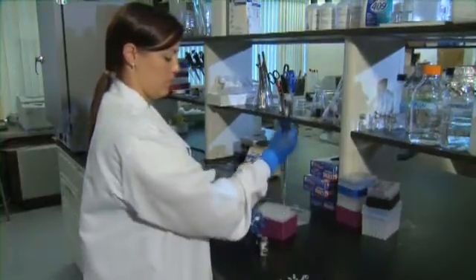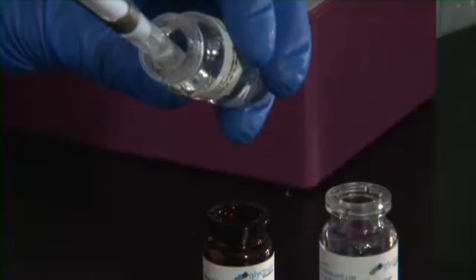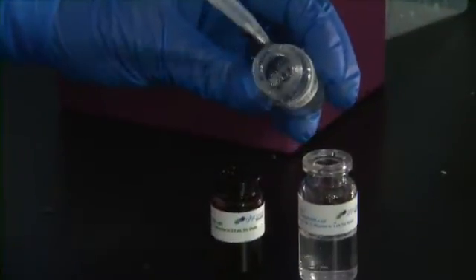Step 2: The contents of the vials are then mixed together in the recommended ratios. The hydrogel is liquid for about 15 to 20 minutes before forming a gel.